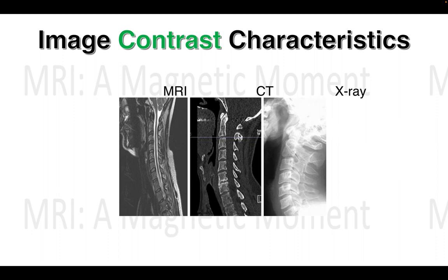So, getting back to the image contrast in MRI, which we will explore further in greater detail in future modules. In essence, magnetic resonance imaging provides exceptional soft tissue detail, and that's the very reason it has become the modality of choice for imaging the central nervous system, joints, specific organs like heart, liver, kidneys, musculature, and other soft tissue structures.